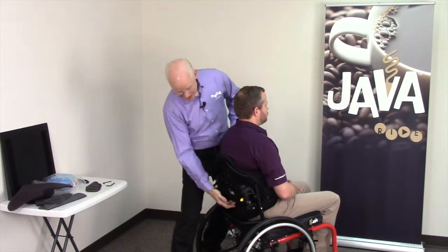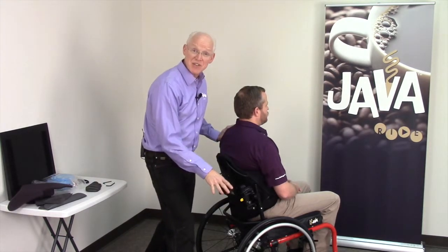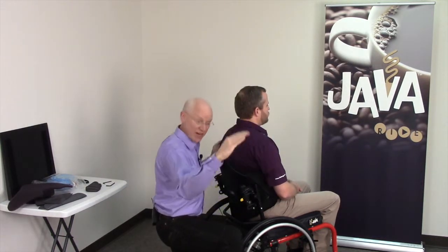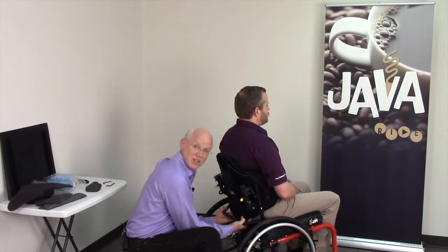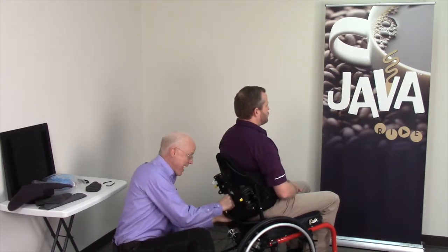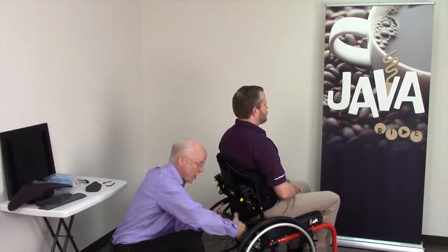The Java back has a unique shell that doesn't extend below the PSIS, but instead has these flexible metal stays that allow me, once I've opened up my seat to back angle, to reach right up in between the client, Ryan, and his buttocks, and I can literally just bend these metal stays back. That allows for a gluteal spread. And when I do that, I restore that seat depth.